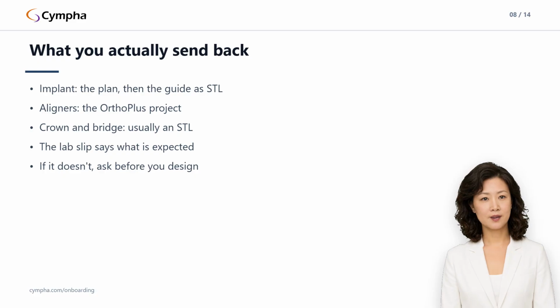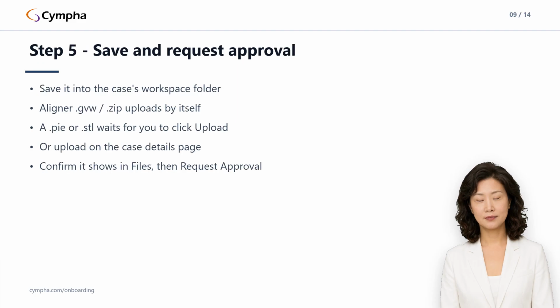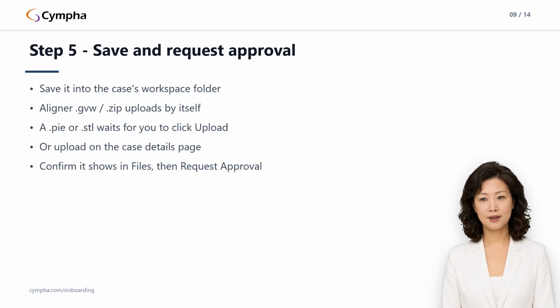One practical note: if you are using the agent, it pauses uploading while an Ortho Plus worker is running, so that program's intermediate saves never reach the cloud. Other CAD applications are not detected, so with those, close yours before you expect an upload.